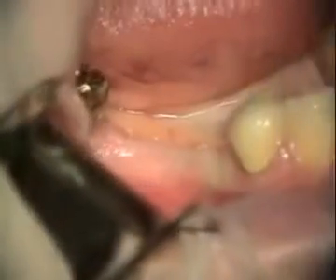Today we're placing the implants in the number 29 and 30 sites. Hold your head over there — good, that's perfect.